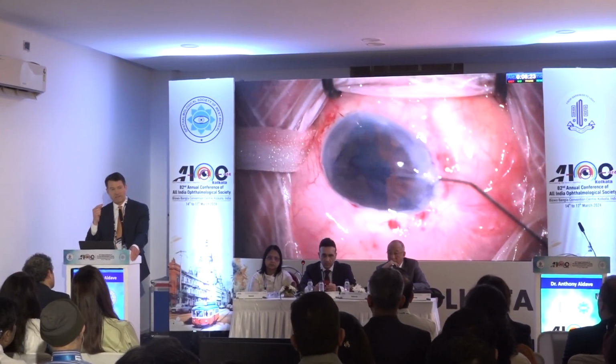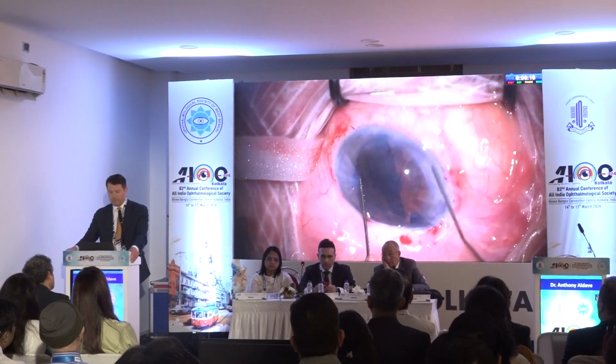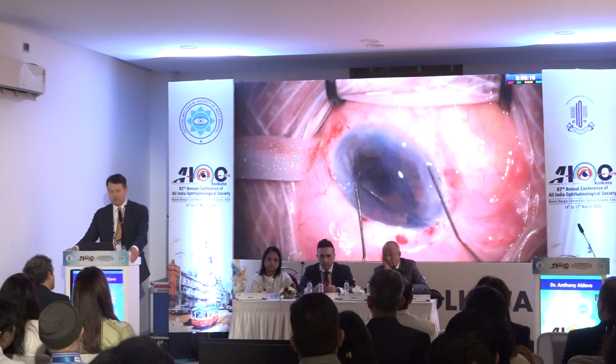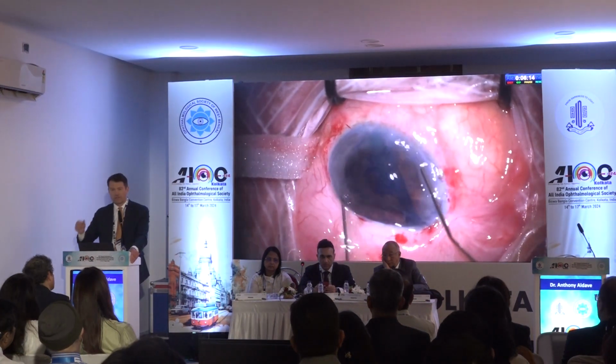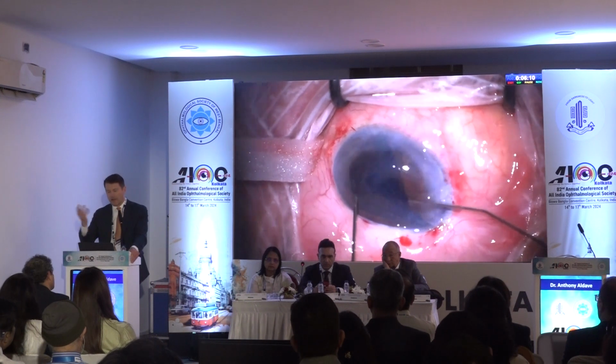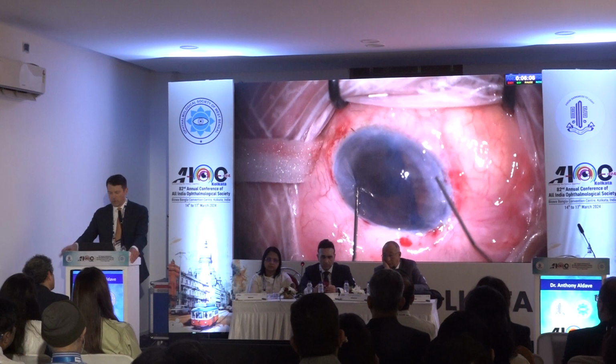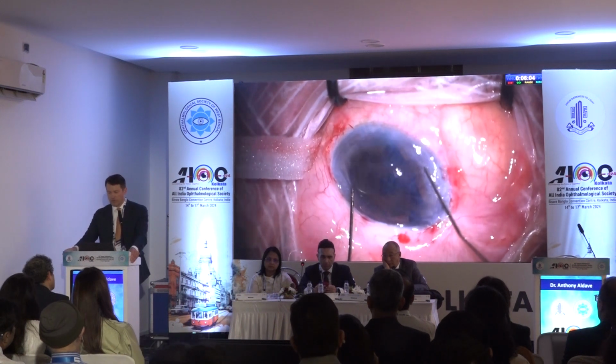In a chamber that's deep, it will not shallow on you during this maneuver. Once you get that portion unfolded, then it's like a routine case. I like this compress and release technique. It's a slow downward movement and then a rapid upward movement to create a vacuum that pulls this graft open. You'll see me use it again here. So it's a quicker upward stroke, creates a vacuum and pulls that graft open.